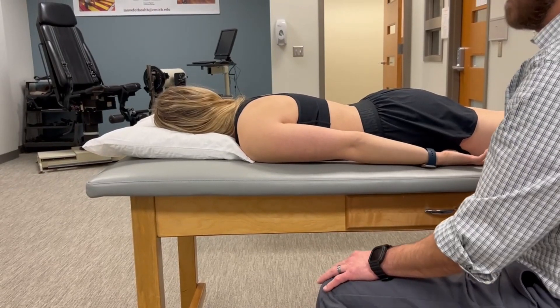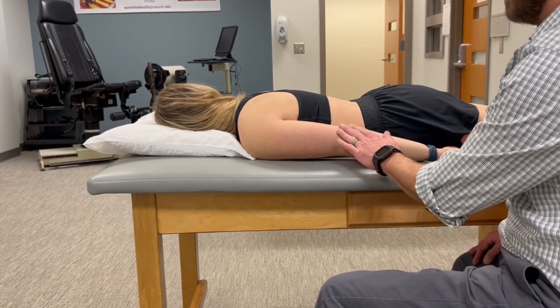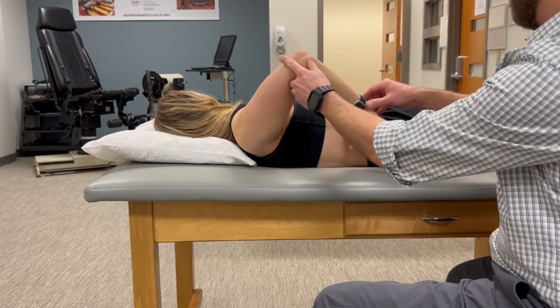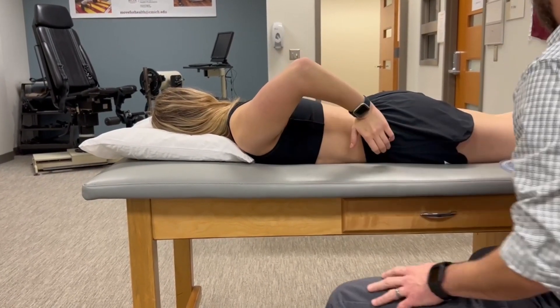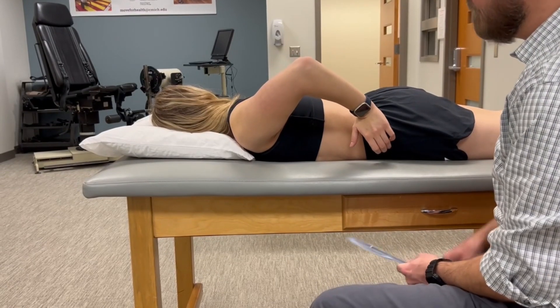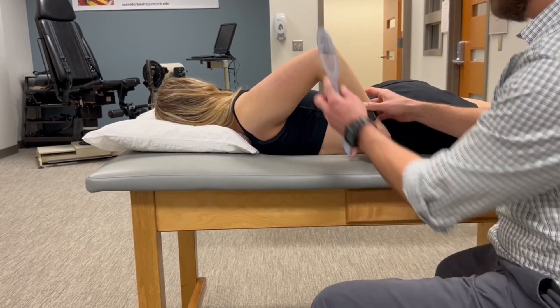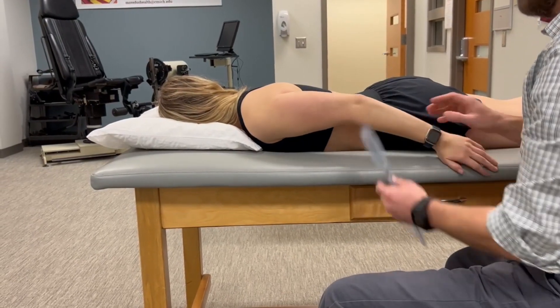We're going to measure shoulder extension active and passive range of motion. Go ahead and bring your elbow up towards the ceiling. We want to make sure the elbow is flexed to avoid maximally elongating the biceps brachii. We also want to make sure that our patient stays in the sagittal plane.